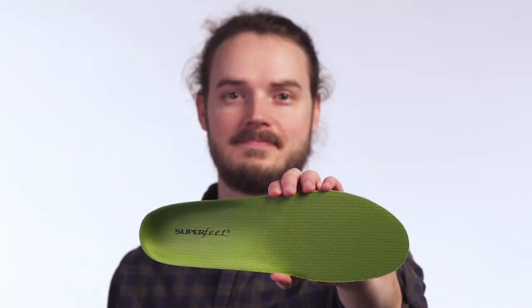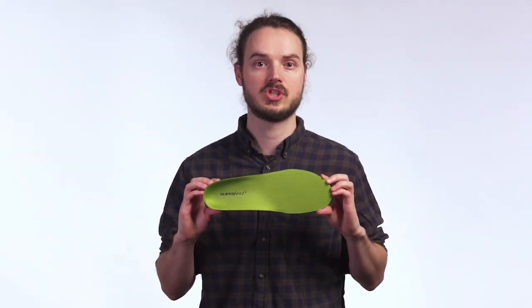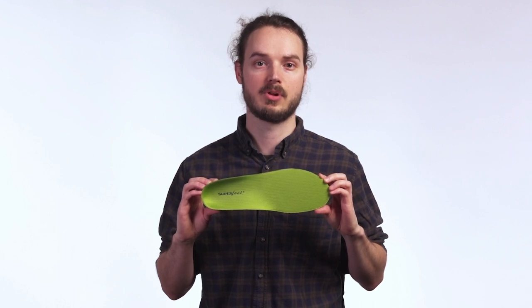Superfeet all-purpose support high arch insoles. Signature Superfeet shape sculpted to deliver unbelievable comfort and long-lasting support for all you do on your feet.